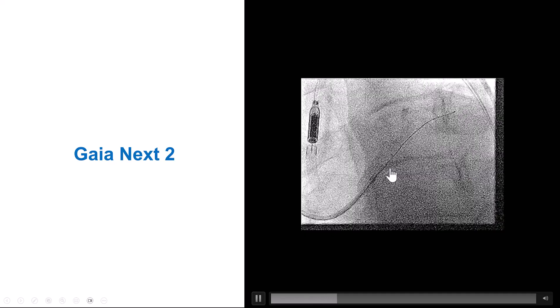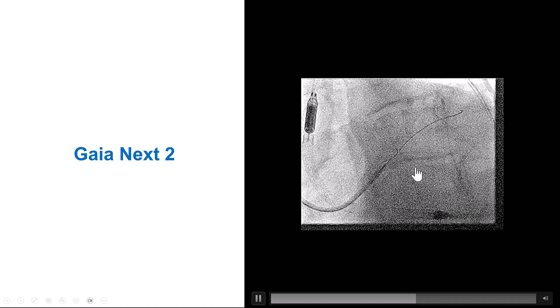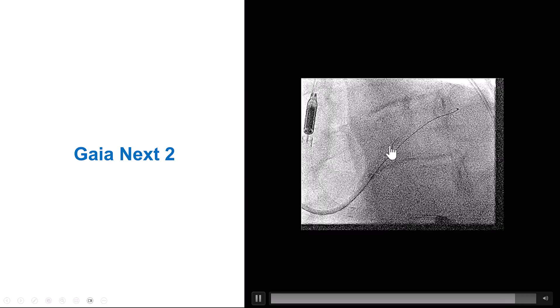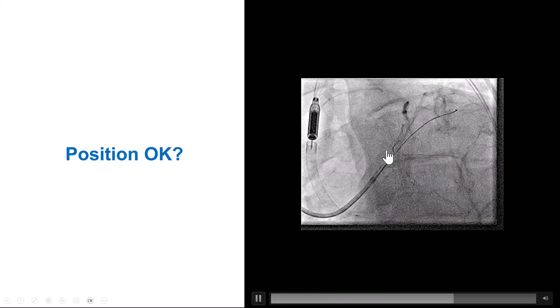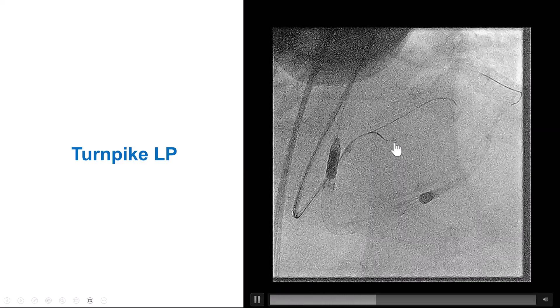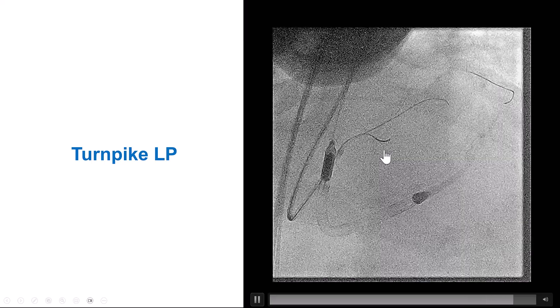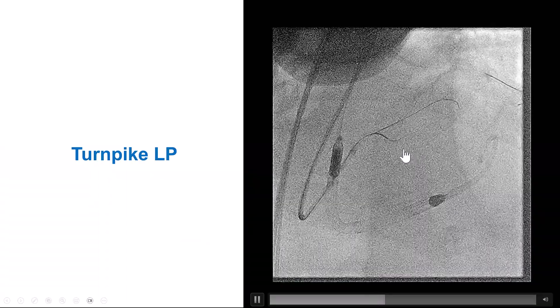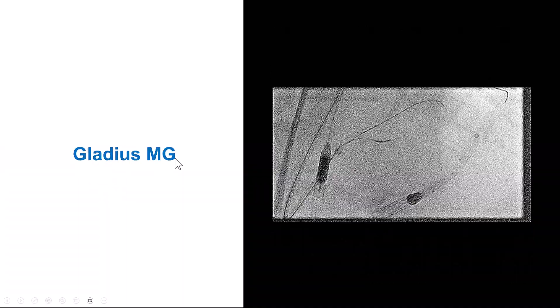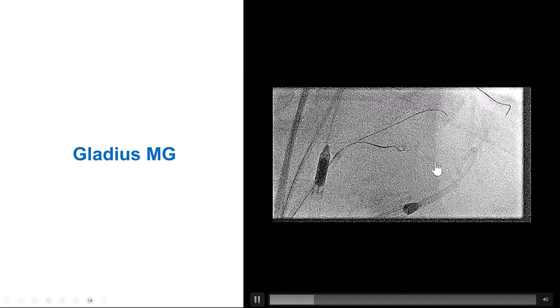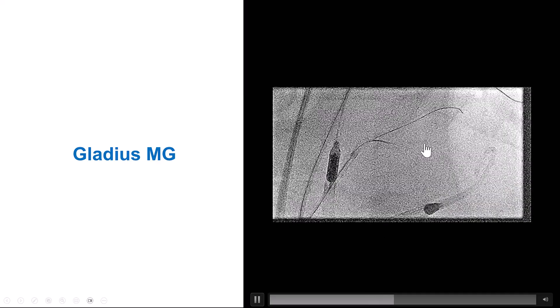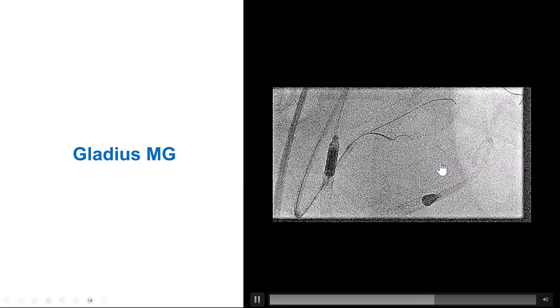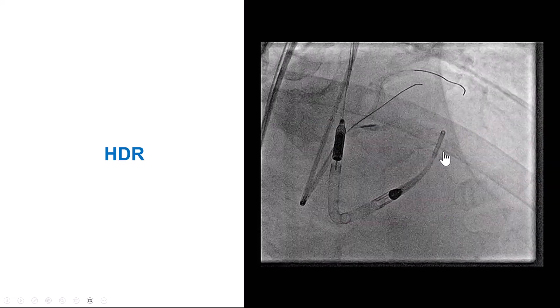Through the Supercross 120, we tried initially with the Gladius Mongo without success. We then tried with a stiffer wire — the Gaia Next 2 — and after a few attempts, the wire seemed to deviate from the course of the circumflex and track along the course of the LAD. We then switched the Supercross for a Turnpike LP microcatheter and tried to knuckle a guide wire with the Mongo, but had significant difficulty. The wire was just buckling and did not want to advance further along the course of the calcium representing the LAD.